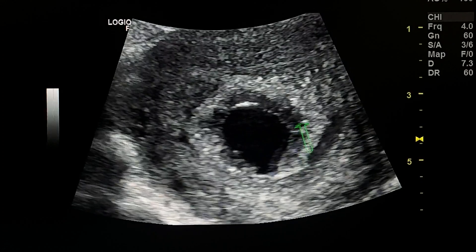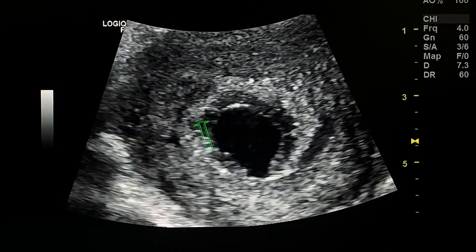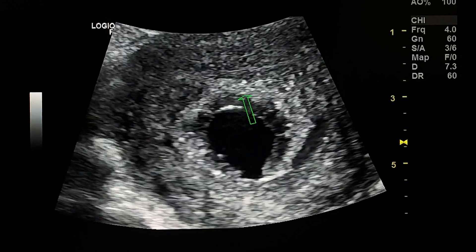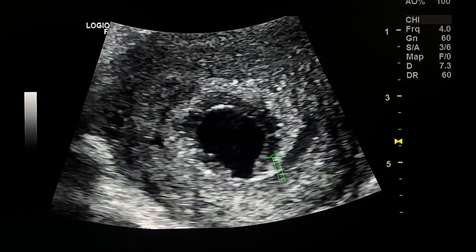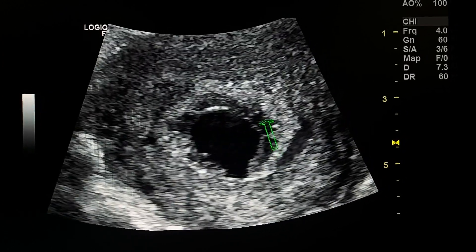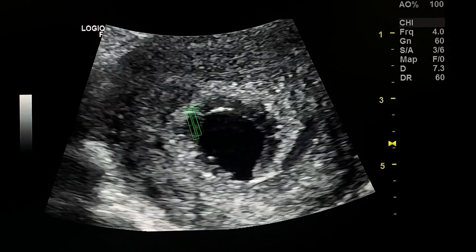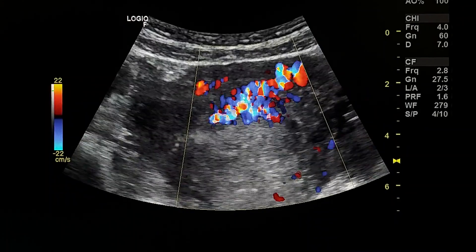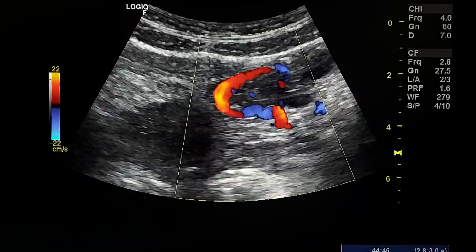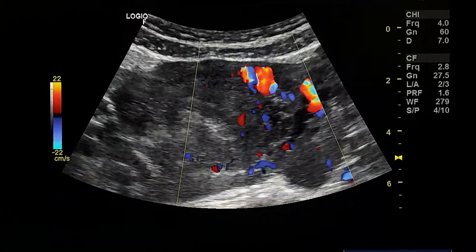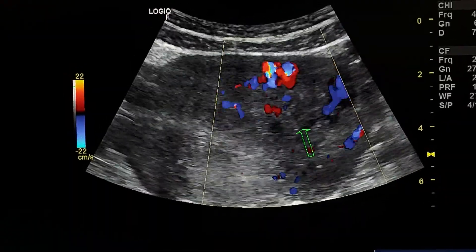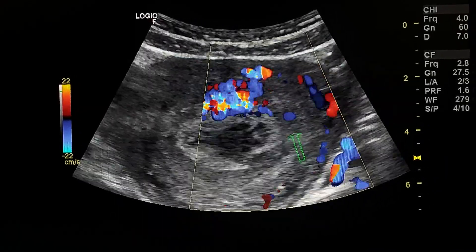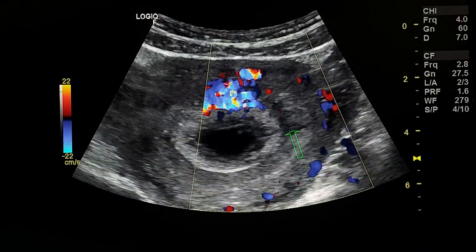This is the wall with hydropic changes. The wall is thick with thick areas inside it. There is a small amount of fluid here inside the uterus adjacent to the gestational sac.